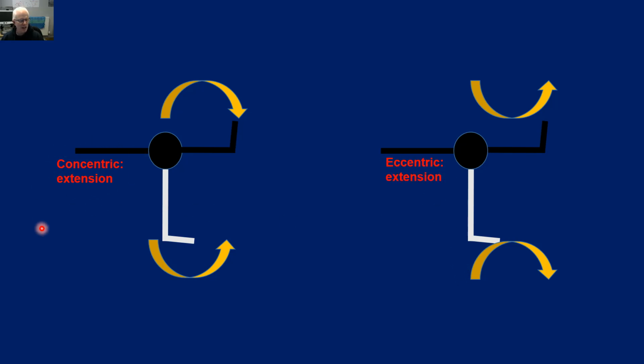In this example over here, we're trying to accelerate the dynamometer arm and it is therefore concentric. So it's really important to get that distinction in terms of understanding the movements. So we can evaluate now, which is another differentiation to isoinertial loading, the amount of torque being produced under concentric and eccentric loadings, which we cannot do when doing conventional isoinertial testing. But you can see the difference in terms of what is being required.